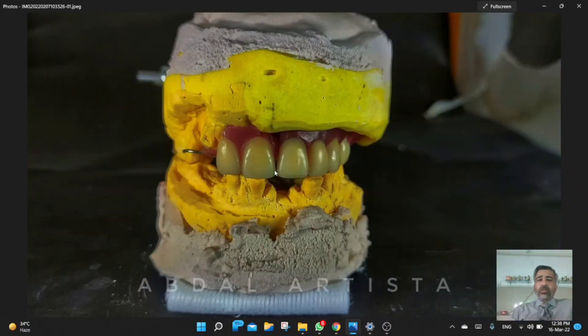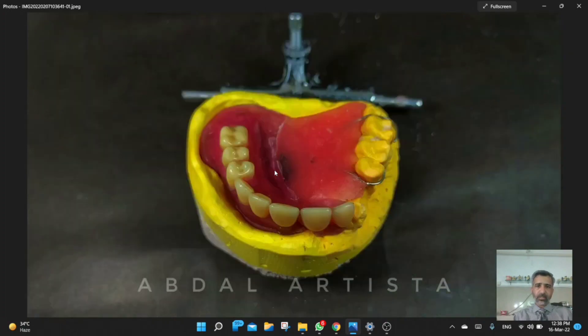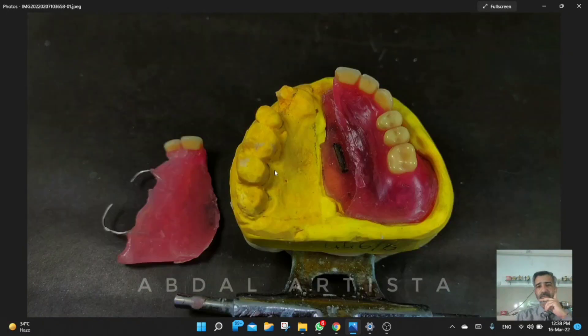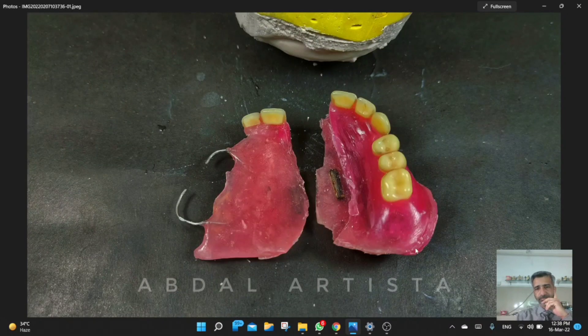This is the labial view and this is the palatal view of the wax setup. The trial had been completed. This is the final wax-up position — first part, second part, guiding groove, and the magnets. This whole plate was then changed: the trial plates were fabricated in self-cure acrylic, while the final plate was transferred into heat-cure acrylic.